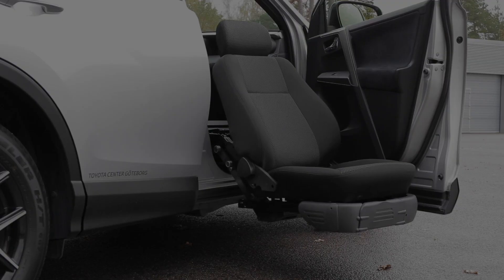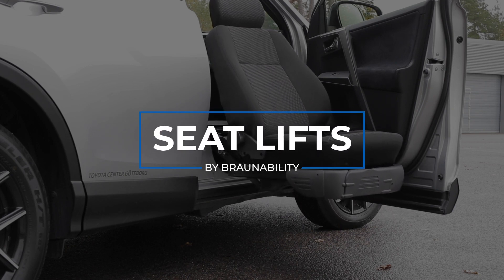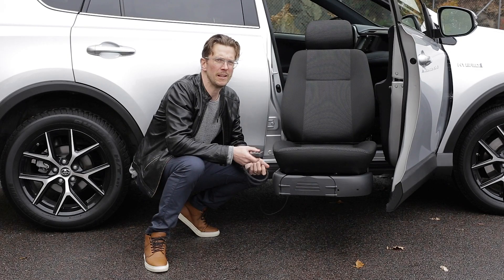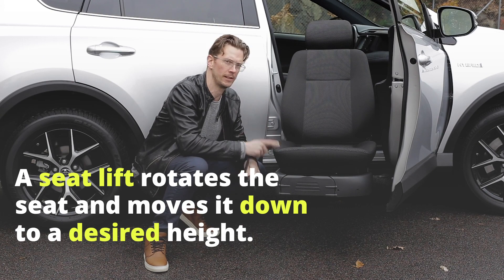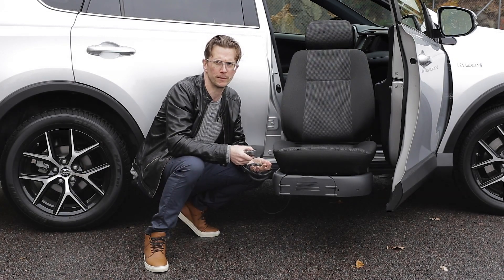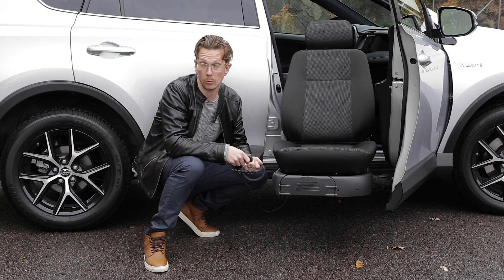Today we're going to take a brief look at seat lifts. A seat lift is much like a swivel seat — it can rotate out and it helps you get in and out of the vehicle. But the difference is that a seat lift also goes up and down. So you can always make the transfer to a wheelchair downwards, and you can make the transfer from a wheelchair downwards as well. It's the easier way to transfer.